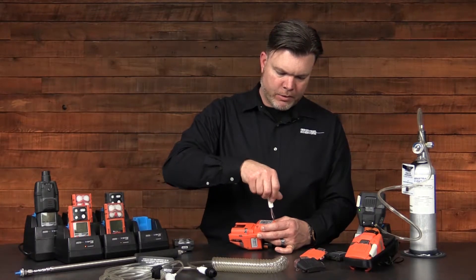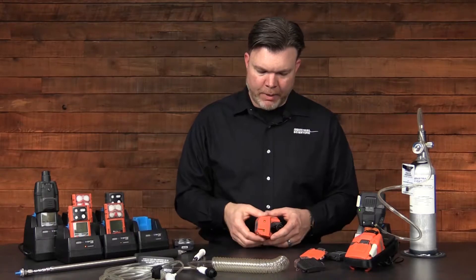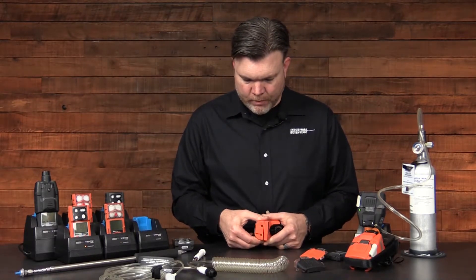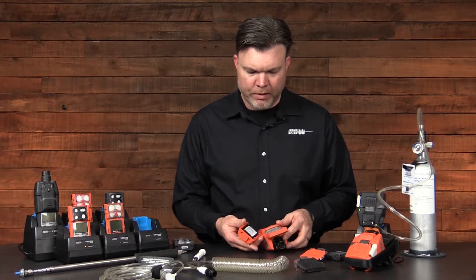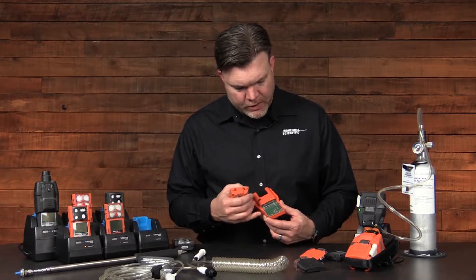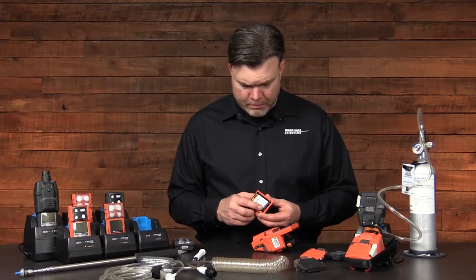Once the last screw is completely loosened, pull the battery pack away from the pump. Be careful — there may be a seal on there that's pretty tight, and you'll have to rock the battery back and forth. But once it's apart, you can inspect the contacts for good contact and no corrosion on the pump itself, and you can also inspect the same on the battery.